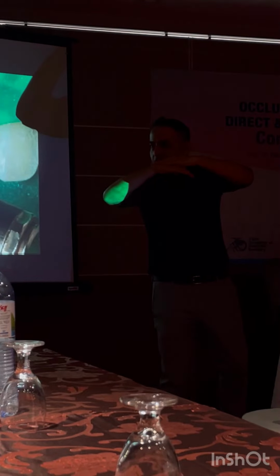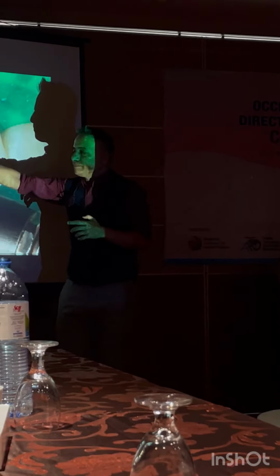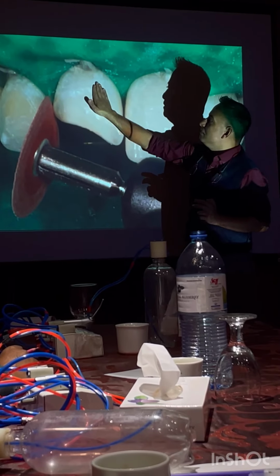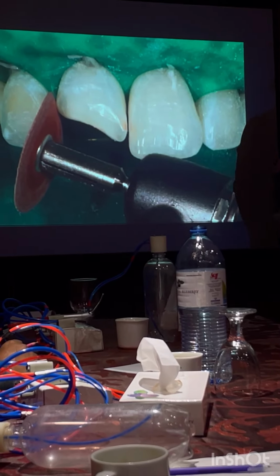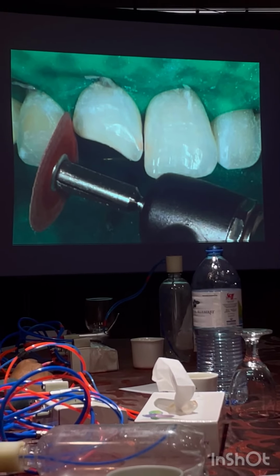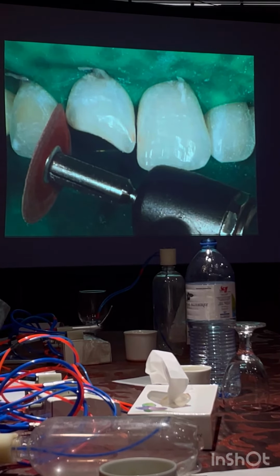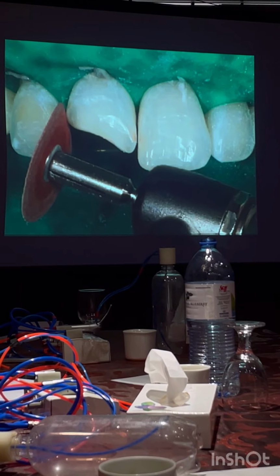Are you getting my point? I think most of you are not doing this step. You need to over etch and your composite should overlap the bevel and merge here nicely. Need to show. I'll show. Is it very clear? Yeah. So these are the steps you follow for class 4. Okay.